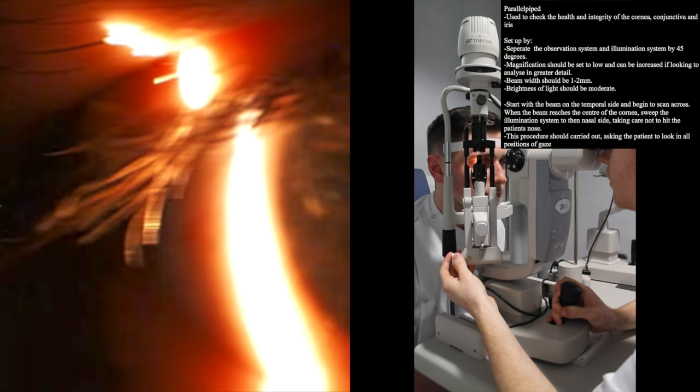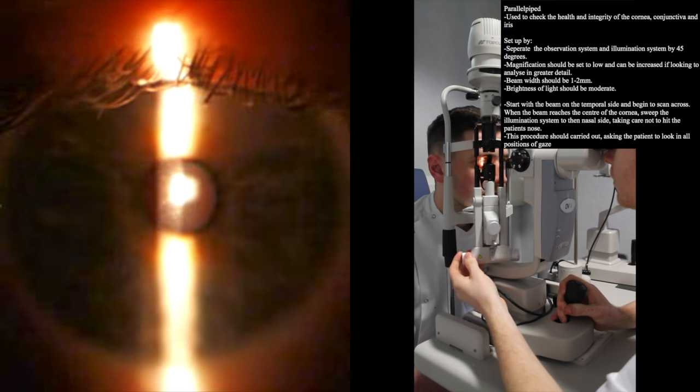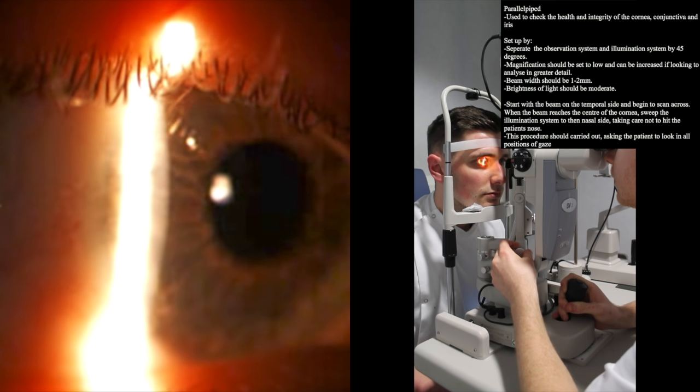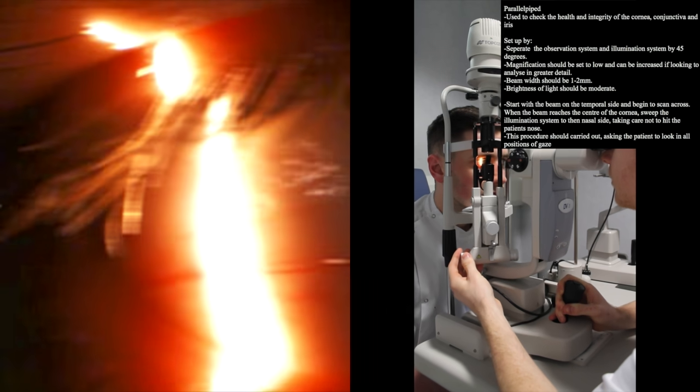This scanning procedure should be carried out in all positions of gaze and be repeated several times to check for any abnormalities of the conjunctiva, cornea or iris.